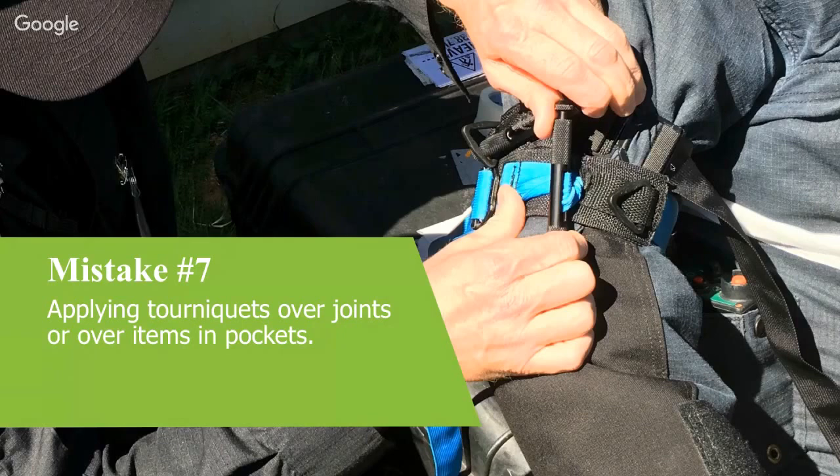But we played around for probably over half an hour, 40 minutes, and we were still having a radial pulse on the current generation bomb suits, which I believe is the same suit that they use worldwide. It's one of the most common suits. That was both for upper limb and lower limb. We couldn't get any effective tourniquet to work over a suit. With a little bit of knowledge, and most EOD operators work in pairs, if not more, you can actually take off a bomb suit quite quickly. So, risk versus benefit, you'd be better off just removing that suit as quick as you can, and then applying a tourniquet.